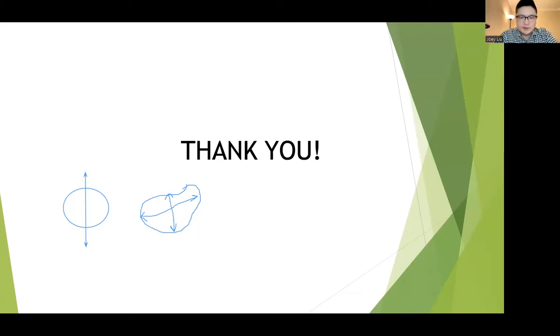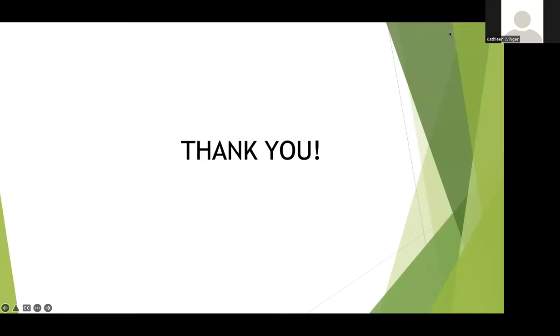Thanks, Mike, for sharing that. Oh, hi, Joey. This is Kathleen. I just have a simpler question. When I've been doing IVC measurements, I've been measuring the diameter of the IVC 1 to 2 centimeters from the RA junction. You're now saying that we should be measuring right after the hepatic vein?